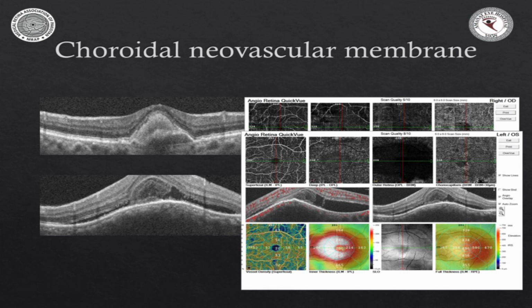So when you've got fluid in a typical CNV, you have to analyze at what level the fluid is lying. The latest guidelines say that intraretinal cysts are absolutely intolerable. So if you see intraretinal cysts in CNV, then you have to treat until the IRCs are dry. But subretinal fluid to some extent may be tolerated, especially if after 2 anti-VEGF injections at appropriate intervals, the SRF is stagnant.